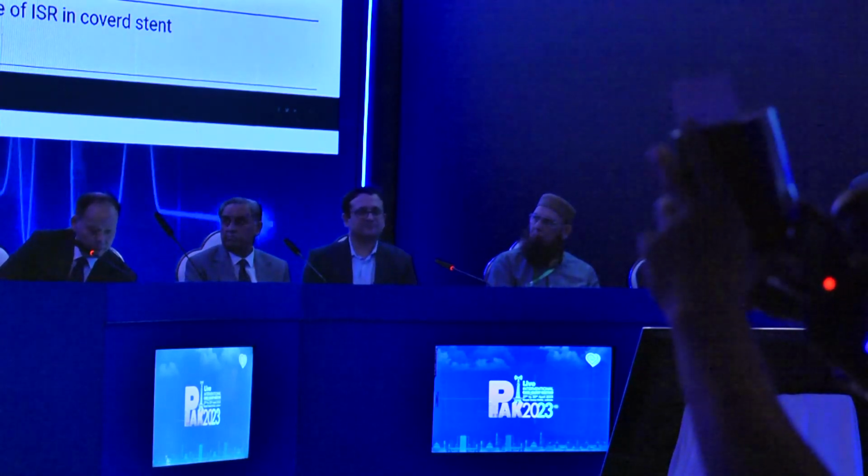This is the balloon in the circumflex, right? It's a jailed balloon. This is now a stent. So this is a 3.5 by 23 stent in the circumflex, and I'm going to take a 4.0 by 15 or 20 NC Emerge. What do you guys have? I'm sorry, 4.0 by 20, we'll take it. So we'll put the 4.0 balloon from the left main into the LAD.